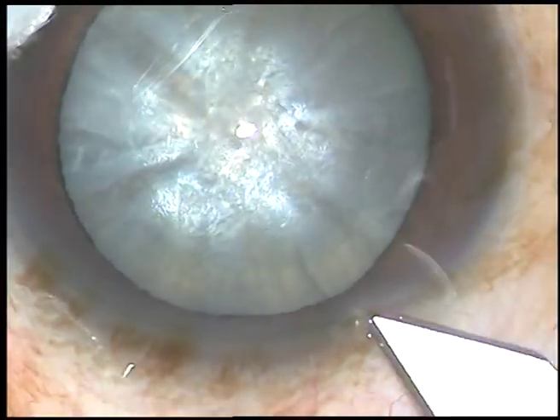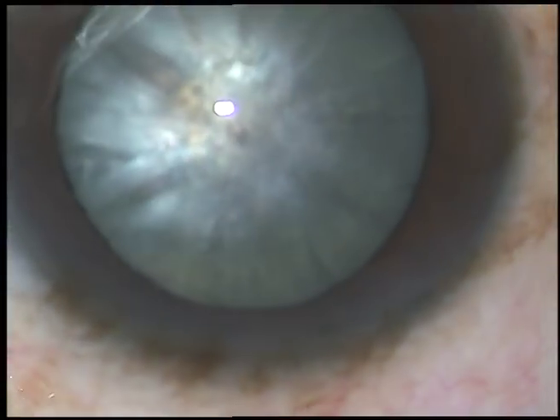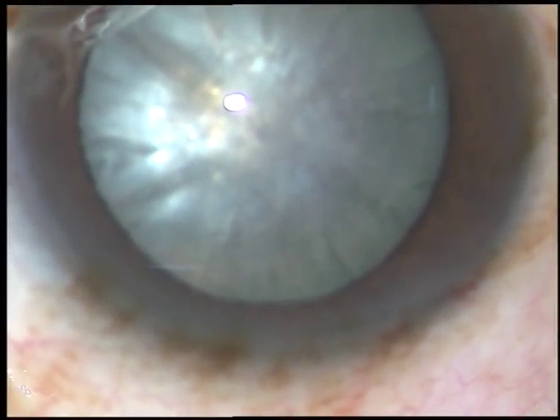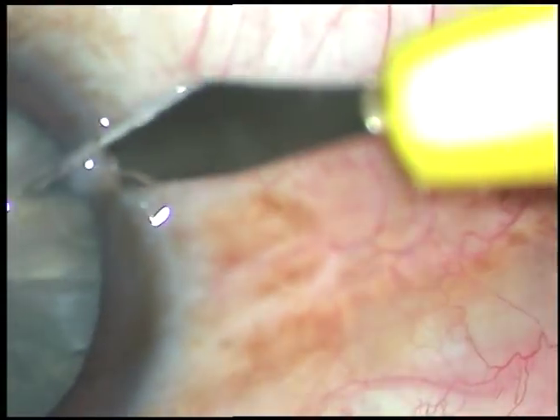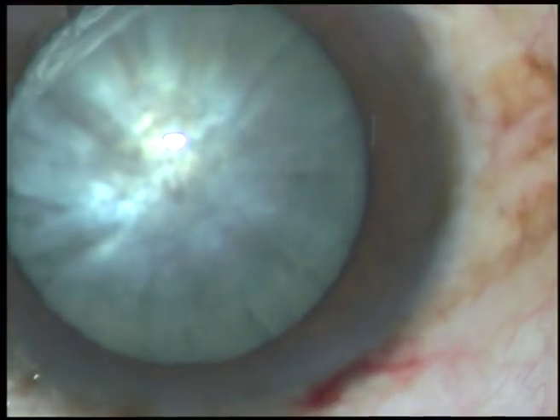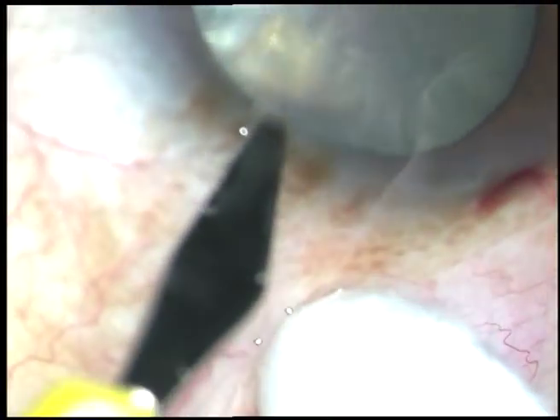Dear colleagues, this cataract looks white, but there is a hard brown nucleus covered by this white cortex. I have taken up this case for surgery. Let us watch the surgical steps — by this time, the incisions have been made.